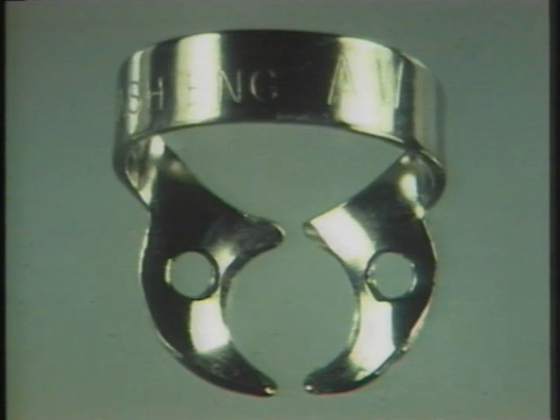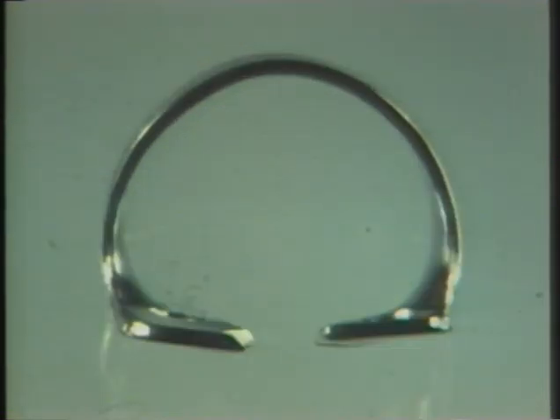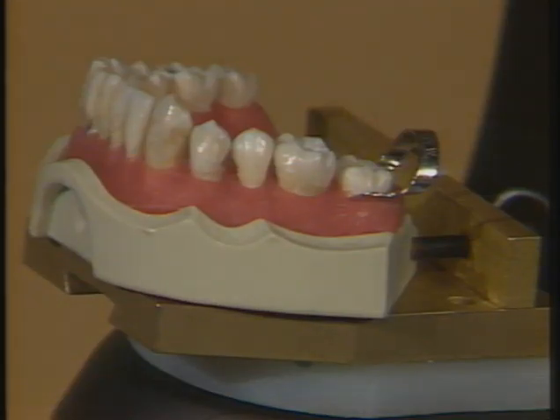A rubber dam clamp has a pair of jaws connected together by one or two sprung bows. The jaws, which grip the tooth buccally and lingually, may be curved or flat in terms of their relationship to the gingival tissue. Where they are curved, the clamp is particularly retentive and therefore suitable for use on partially erupted teeth, but local anesthesia will be required.